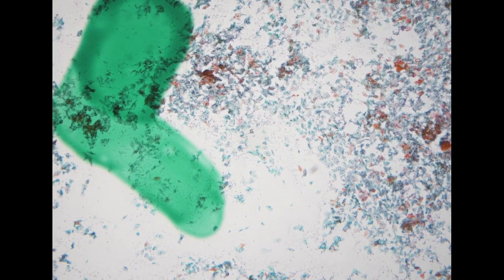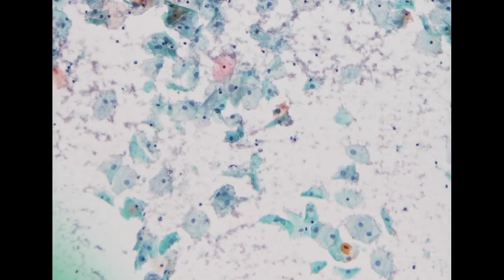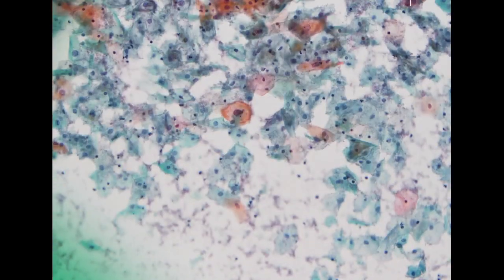Let's move to the pap smear. This is a 47-year-old female. So on low power, it's cellular. It's relatively clean. We don't see a lot of inflammatory cells in the background. So in this low power feature, we know that we are looking for either precursor or organism, microorganism.